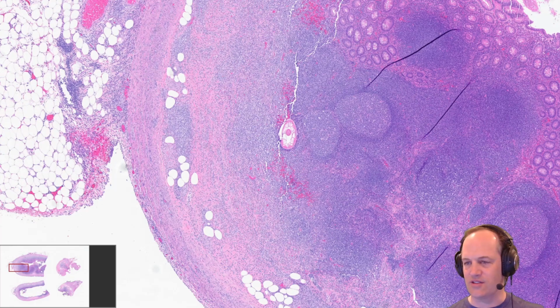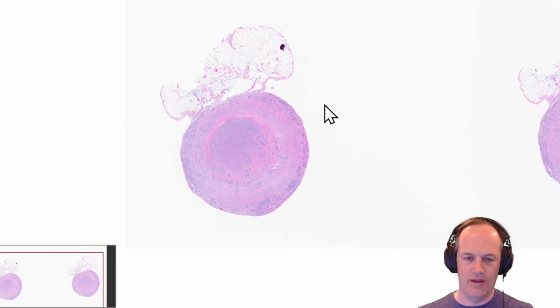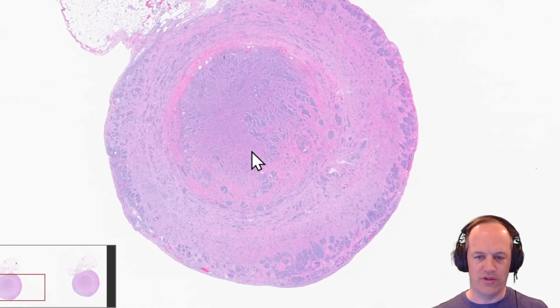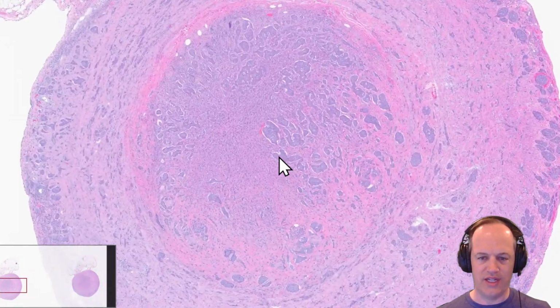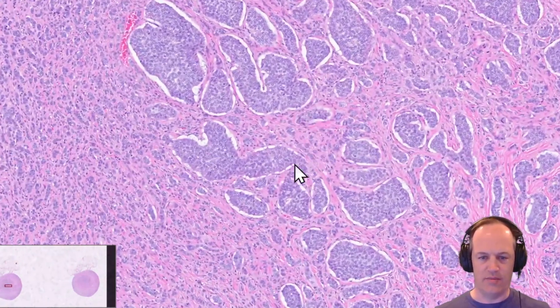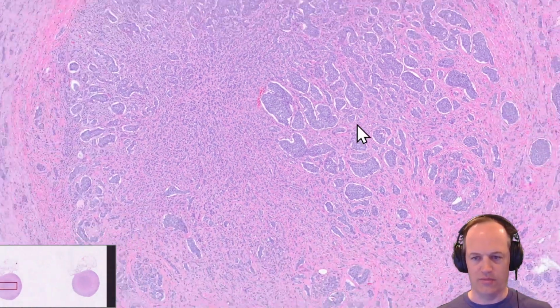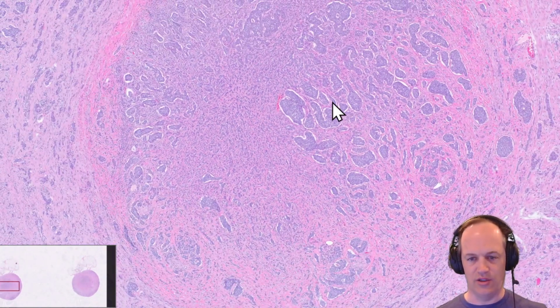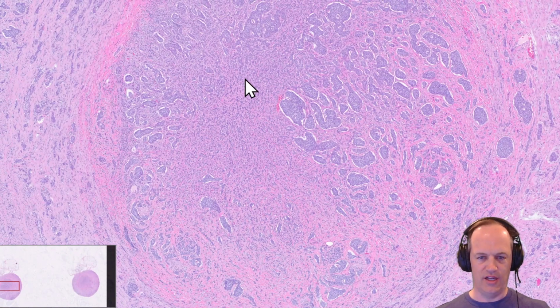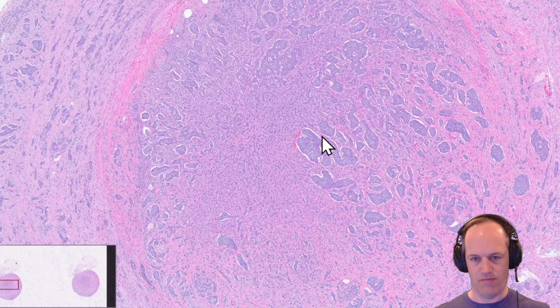All right, and the last thing. I talked early in this presentation about why we ink the base of the appendix, and this is why, because in as many as 1% of pediatric appendectomies, you're going to find this, and this is not appendicitis. So the lumen here is obliterated. Grossly, this is going to look like a yellow nodule. And so anything that looks solid in the appendix stands out. You're going to want to take a section of it, because this might be this.